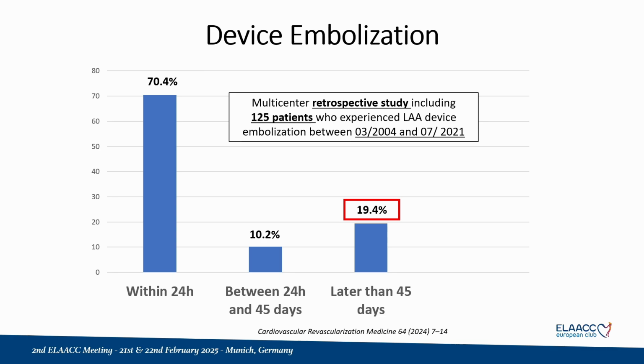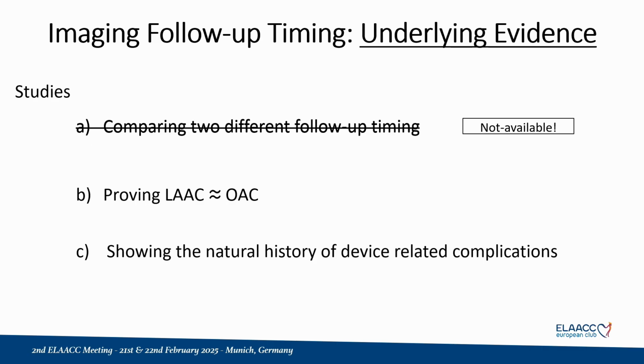Then finally the device embolization. This is the largest multicenter retrospective study, including 125 patients. One fifth of the cases was observed later than 45 days.